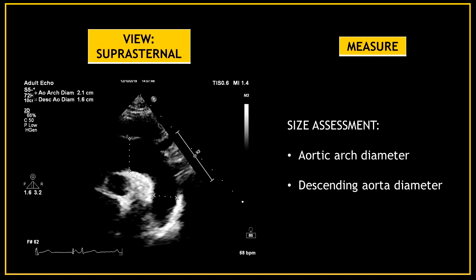After the visual assessment, you can perform a size assessment. Measure the aortic arch diameter and the descending aorta diameter.